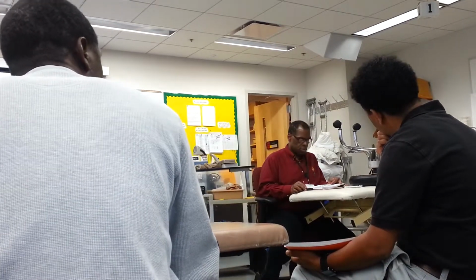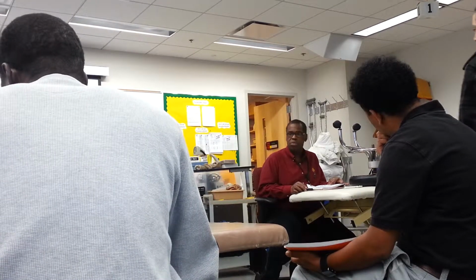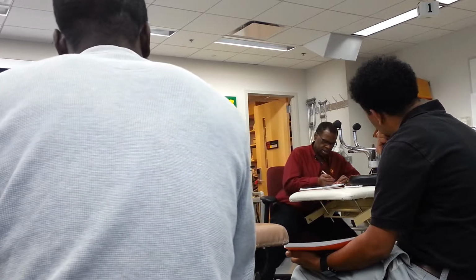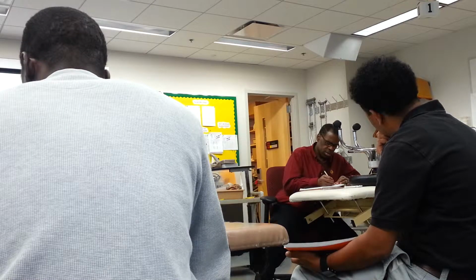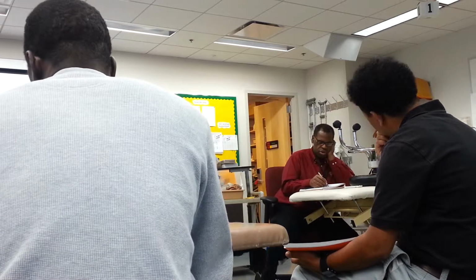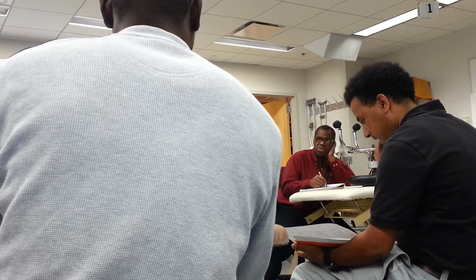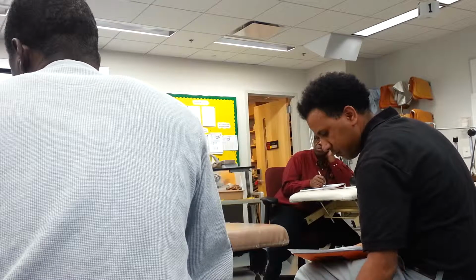Parameter. So, if I'm trying to treat someone with these parameters on the left, on 25 at the top, if I'm trying to get that, what do I say? I said intensity, rate, width, and mode. All right, so I'm trying to treat acute pain, we'll say acute edema with a lot of pain, if you want to look at it that way. Muscle spasm with a lot of pain, we'll say it that way. Wound healing, and peripheral nerve disorder.